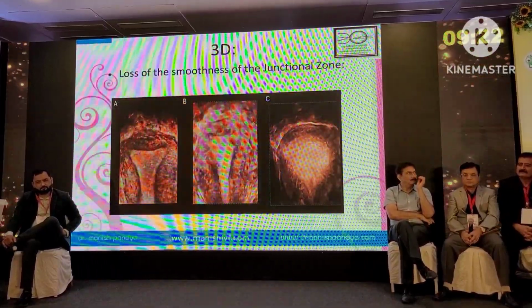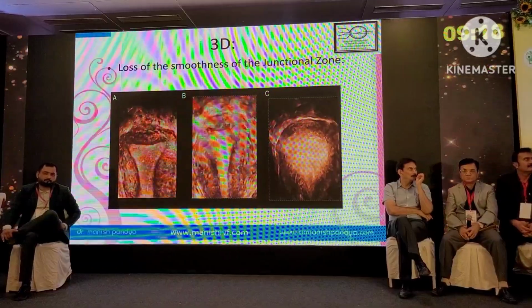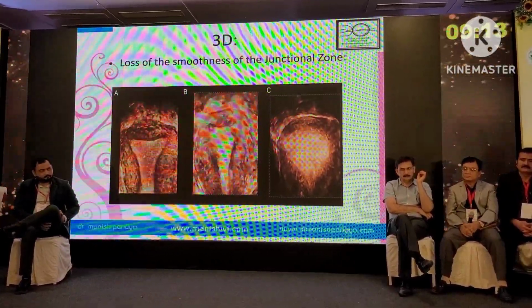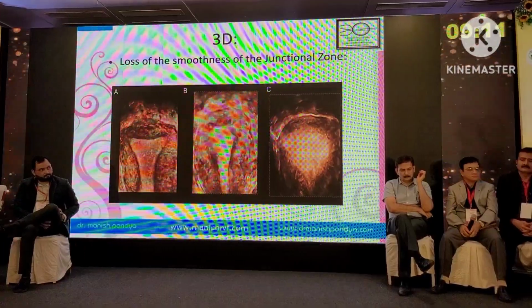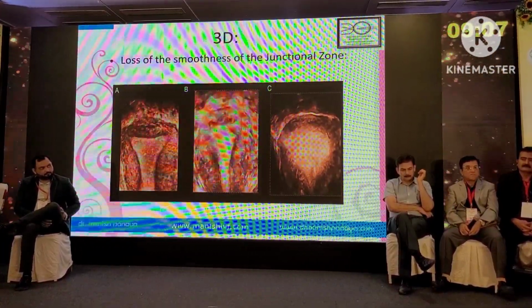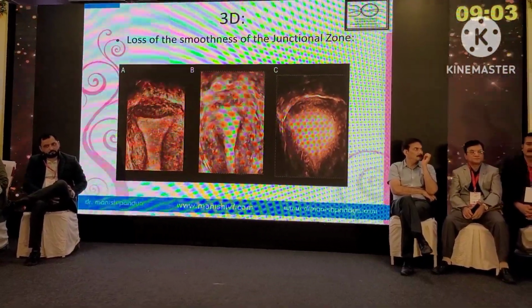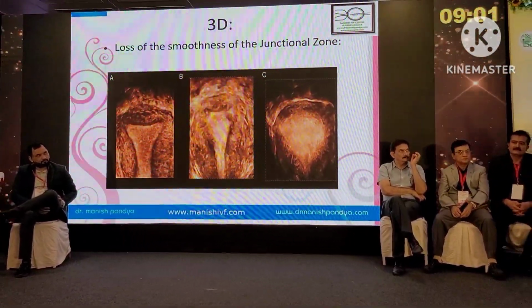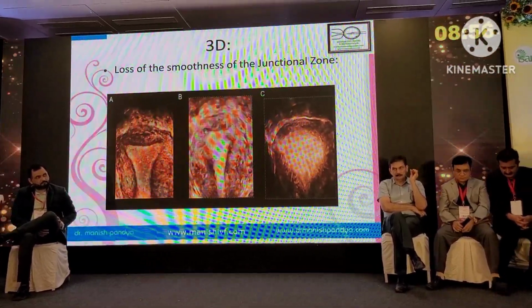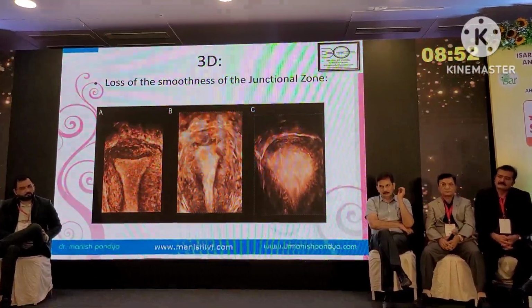In adenomyosis, if you do a very detailed vascular study, you will find that the blood vessels are very random. They run crisscross, and there is a completely disturbed circulation that will differentiate it from normal anatomical structures, which are constitutionally made as per the architecture. So there is a chaos of vascularity. Yeah, absolute chaos. There is an absolute traffic jam, you can say. And 3D is also very helpful because you can see loss of the junctional zone.